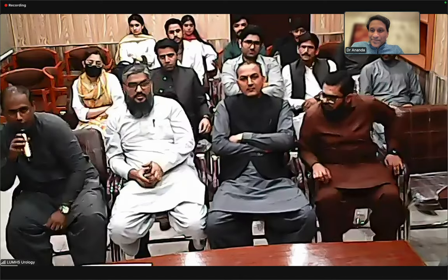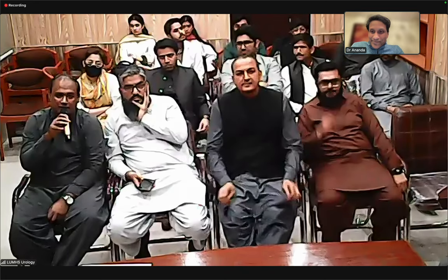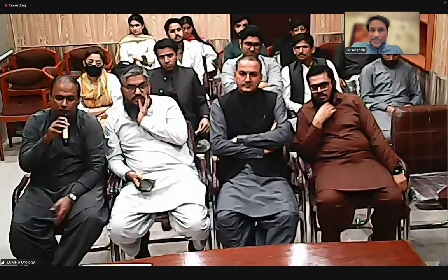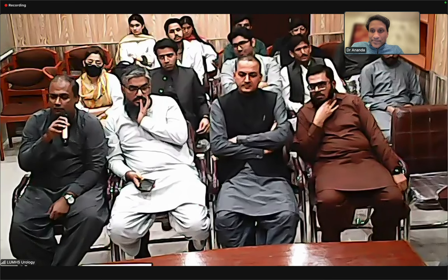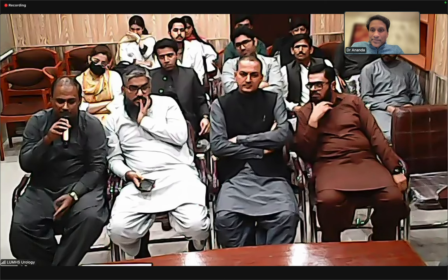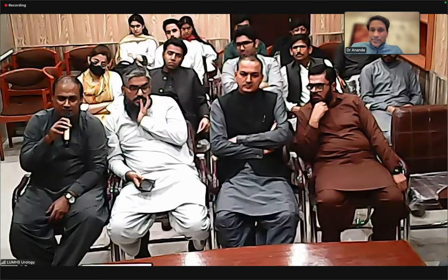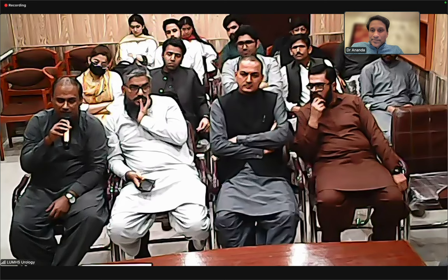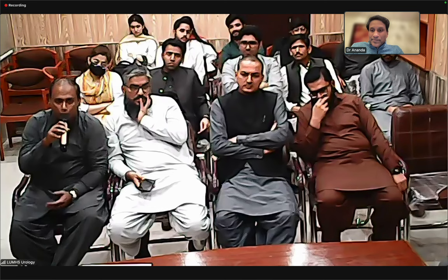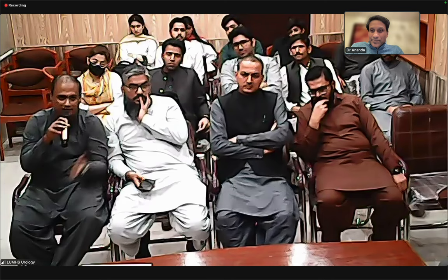Thank you, Dr. Ananda. Dr. Tabu here. Actually, you gave a good presentation. My query is because, as you said, these all new gadgets and the availability, because in our part of world, most of the centers would be having these kind of lasers. But we are having a 30 watt Holmium laser. So we don't have that advantage of the prevention of retropulsion. So before these gadgets were available to you, and the basic maneuvers such as tipping the head up, and slowing the irrigation flow, what else you were doing to prevent the retropulsion of stones apart from these baskets and all?